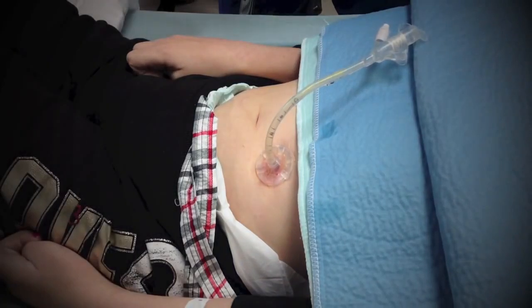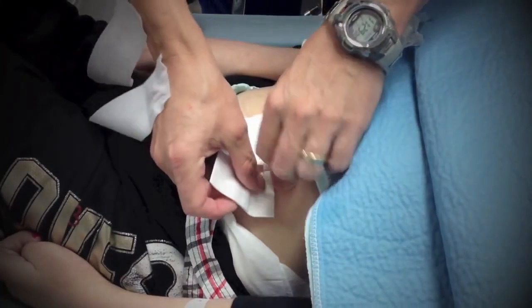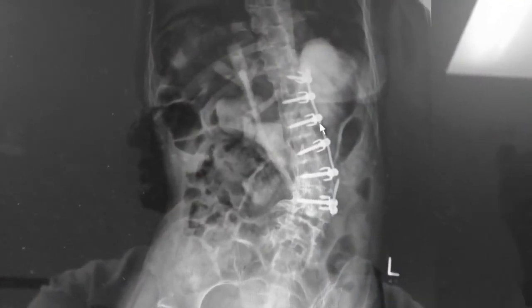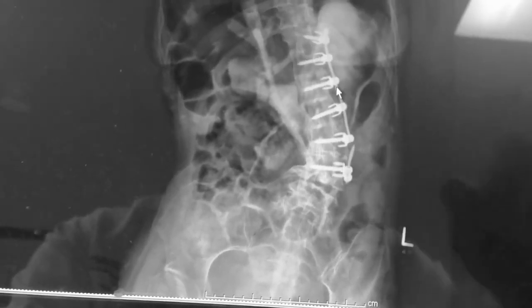Doctor, is there any pain with a feeding tube ever associated with it? There shouldn't be. No. After the tube replacement, the X-ray will be performed to confirm that the gastrografin, the material, is within the contents of the stomach and bowel.